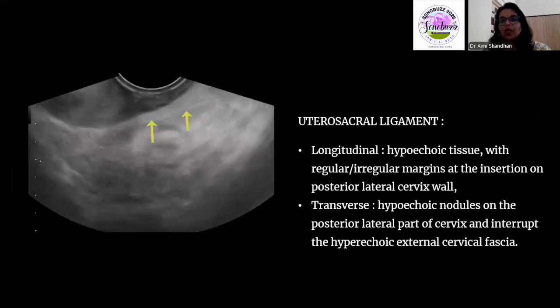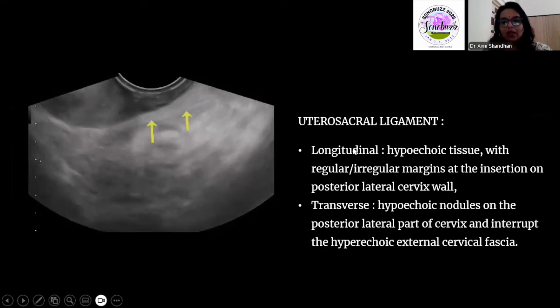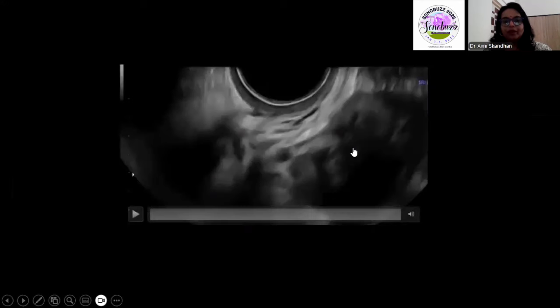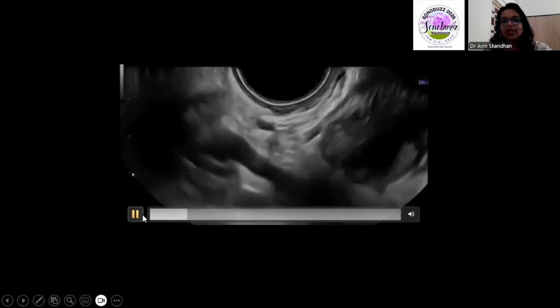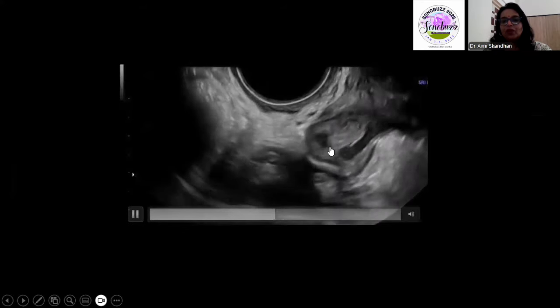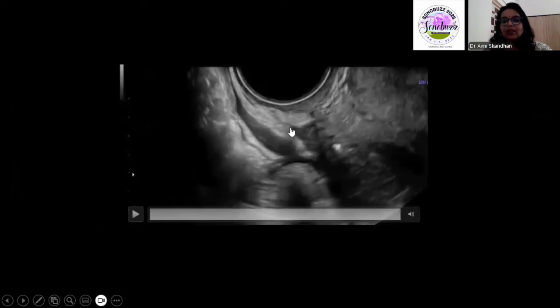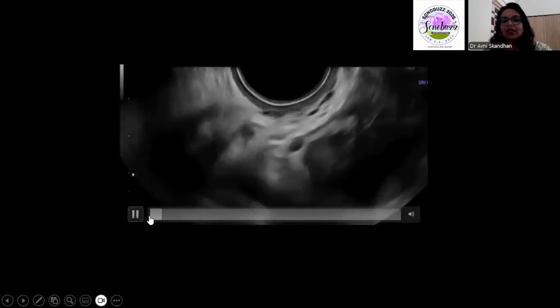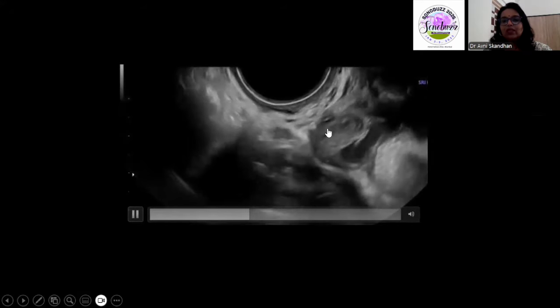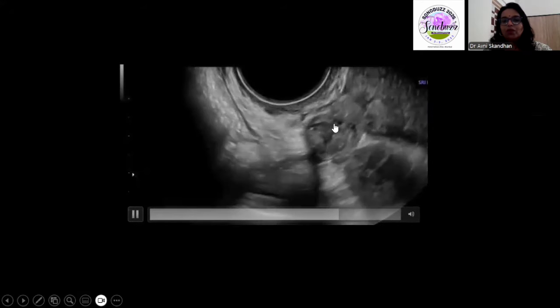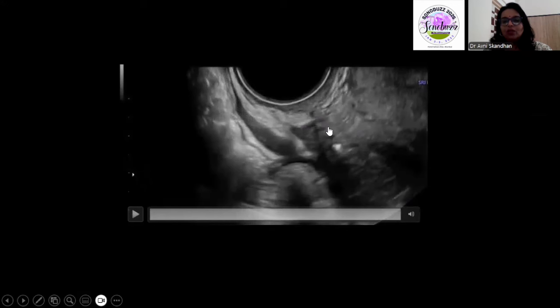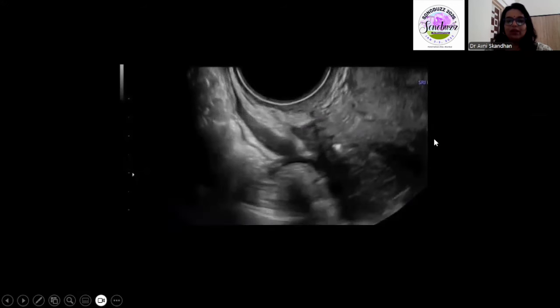We often find deposits along the uterosacral ligaments. In this particular case, you can see an endometrioma, and when you trace further you see deposits along the uterosacral ligament with thickening of the ligament. This is an ovarian endometrioma with adherence to the uterus, plus a deposit along the uterosacral ligament.